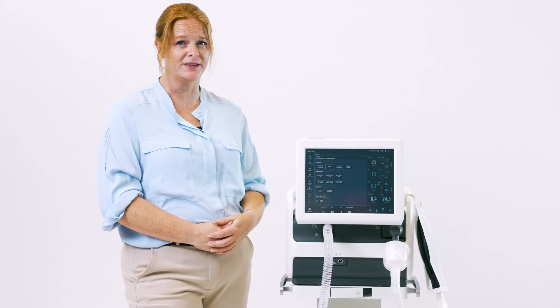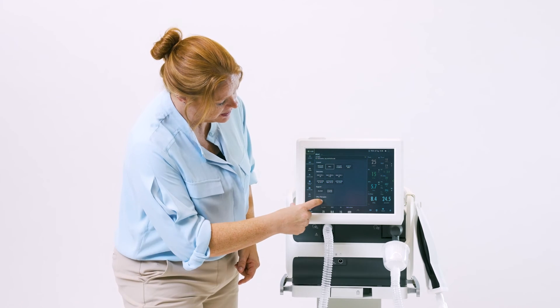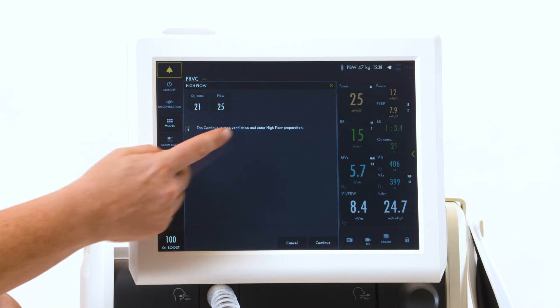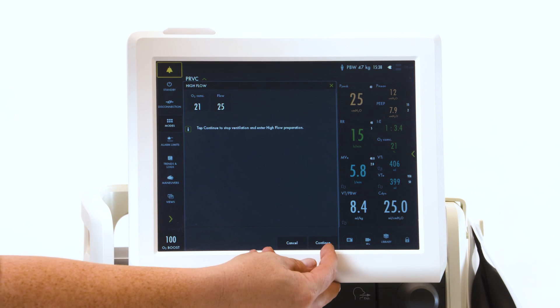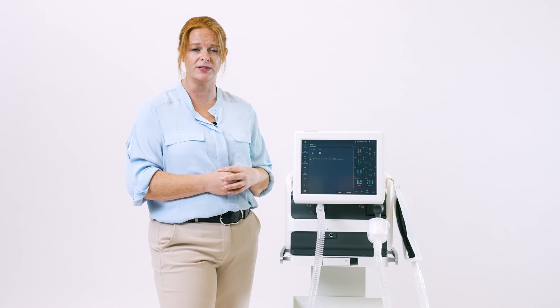High flow is located at the bottom of the screen. Touch and your settings will come up. Cancel and continue are down here. Remember, if you touch continue, it does stop ventilation to go into high flow therapy.